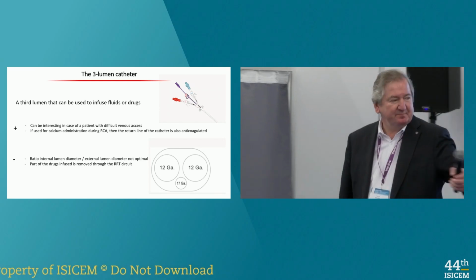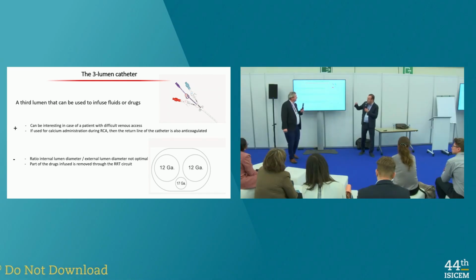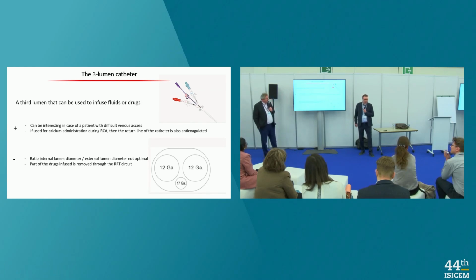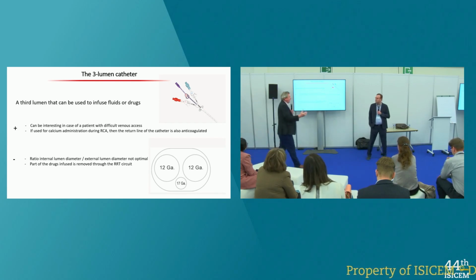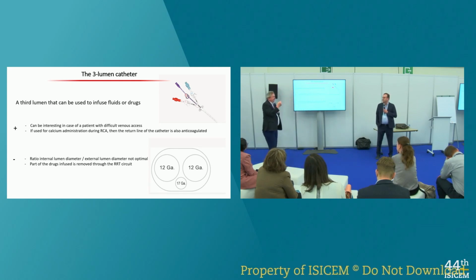Okay? So, Patrick, I understood. You recommend to place the tip of the catheter inside the right atrium? Yeah. Coming back from the story of the chronic dialysis patient, we do this all the time. But you need really very soft catheters.